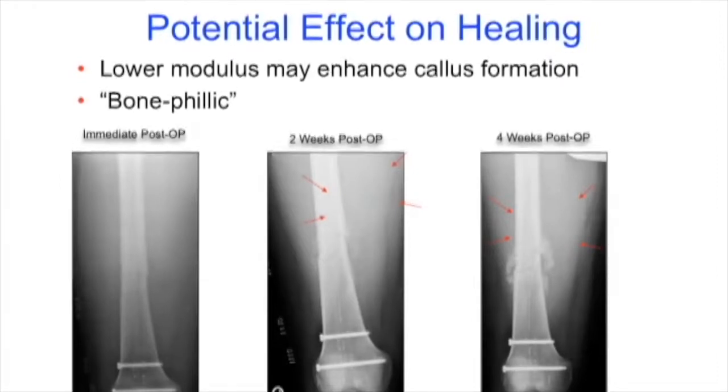You can argue that for traditional metal implants, you probably would see the callus formation that you see here at 2 weeks more around the 4 to 6 week mark. And for the 4-week implant that you see here, you probably see it more around the 8 to 12 week. And so you're really placing the load of the healing a lot sooner, which is favorable, particularly for plate implants, which we'll go into a little bit.